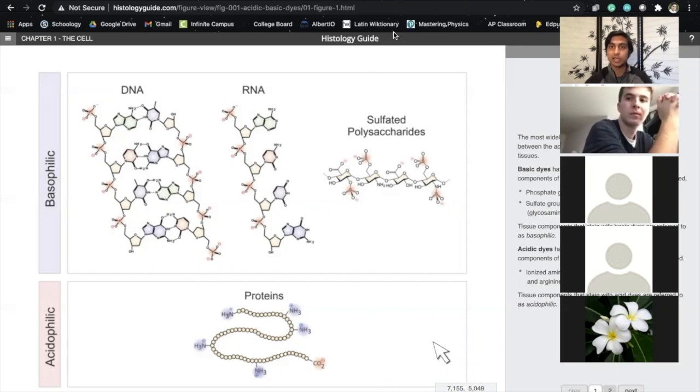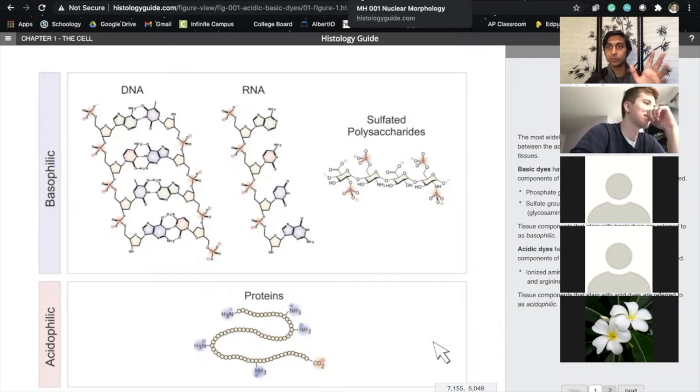I see the chat. Exactly, right in the nucleus. So when we start to look at these, you'll know exactly where the nucleus is because you'll be looking for that purple color. And then you have the reddish color, which is the proteins. This one's a little bit more abstract because proteins are everywhere. They make up the cell. You'll begin to see that with certain cell types, more proteins will be present. We'll talk about that in more detail, but I don't want to talk about it too much right now. So you have some bearing for what we're looking at.